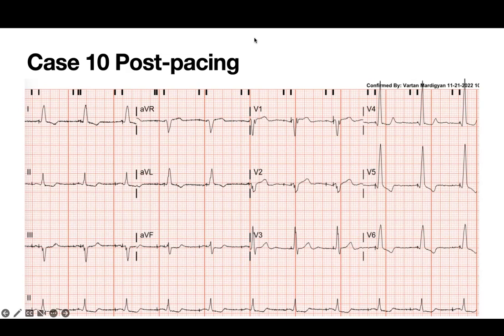Because you're not getting such a great ECG, I think 2 or 3 went through to the left side and came back. And then at the end, I was like, okay, I'm not going to get an R prime. I'm probably going to get something like this. This is the best result we could get. LVAT 110 milliseconds, almost 120. But if I look at V3 and V4, I know I'm close to the left-sided endocardial surface. You're not going to get an ECG like this without being close to the left side. So we kept it like this.